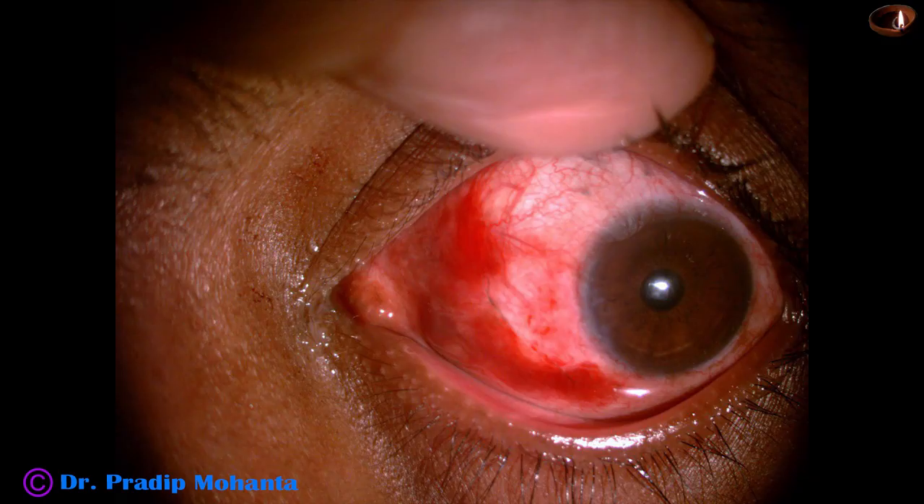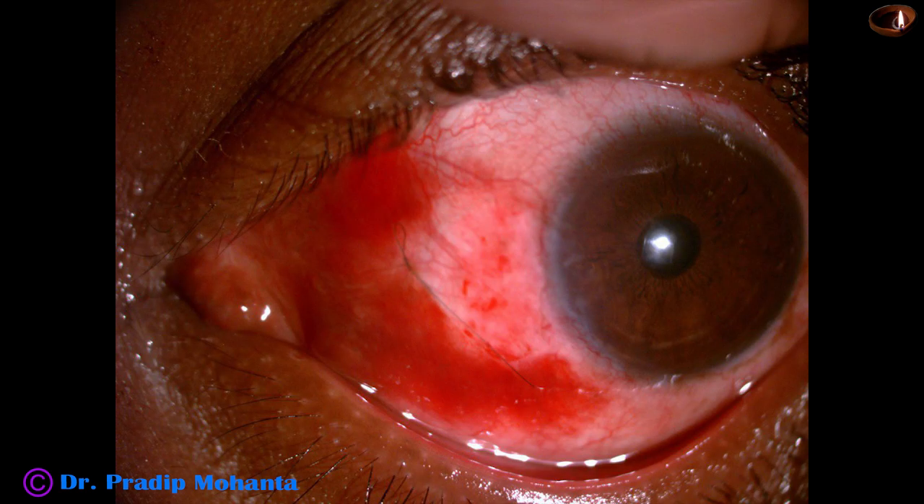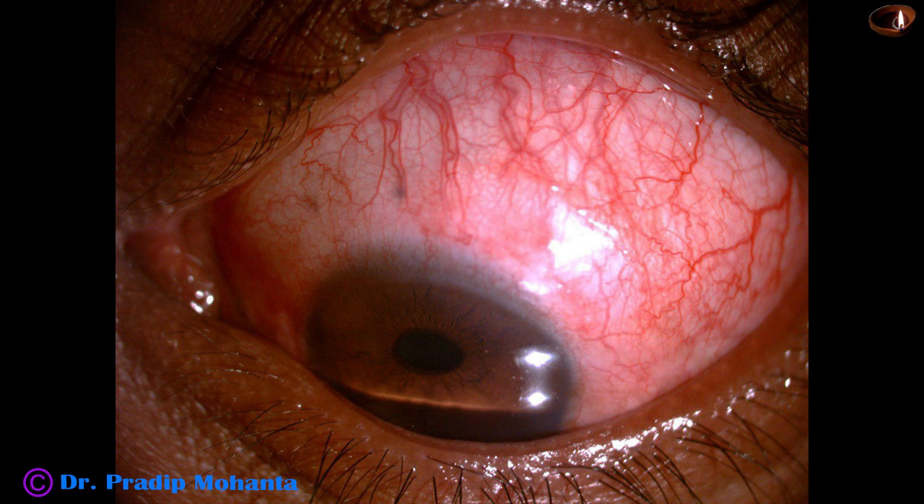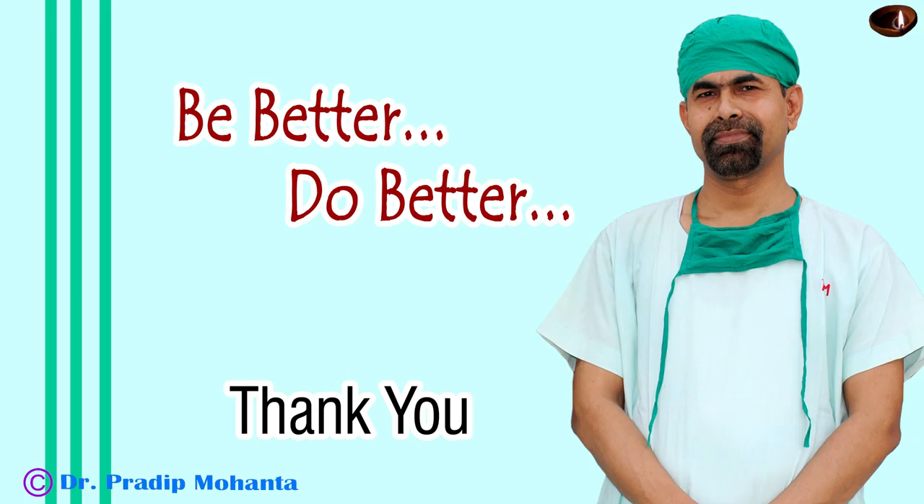Here it is. You can see that the conjunctiva is nicely opposed to the graft, and the graft is very nicely in place. This picture is after 20 hours. The host area is so clean — it has almost epithelialized overnight. Thank you very much for your attention. Hope this video will help you in doing your pterygium surgeries. Be a great surgeon and serve your patients with love, respect, empathy, and great surgical competence.